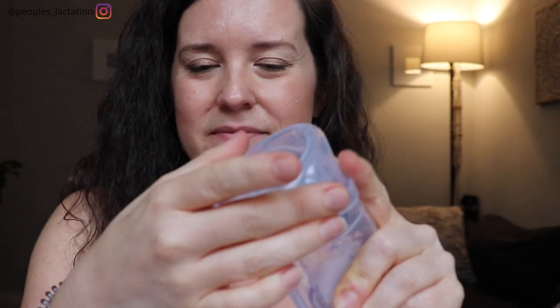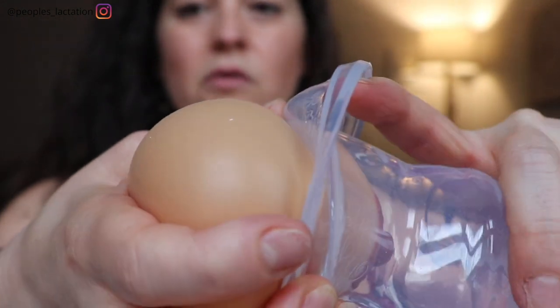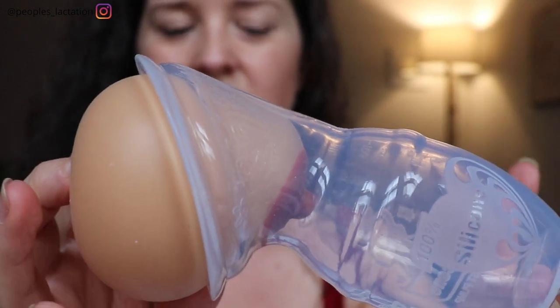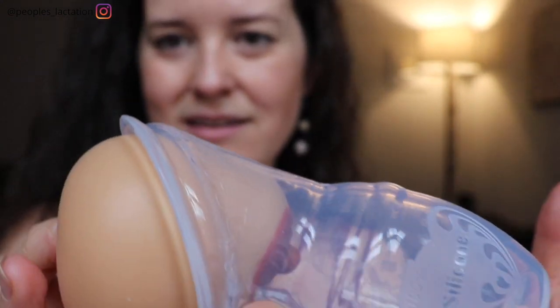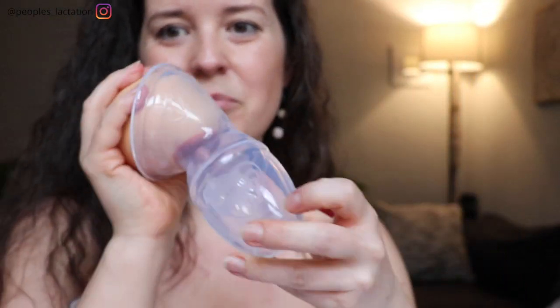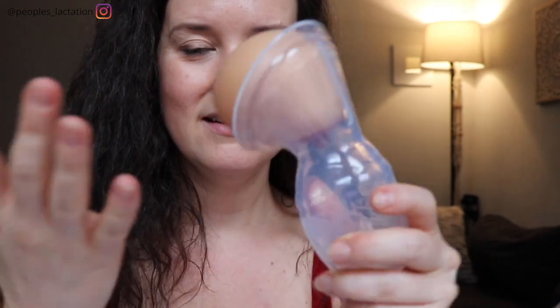The other way to put it on, which is going to form even stronger suction so this thing is not going anywhere, is to squeeze the bottom, then flip the flange part inside out. You might have to hold it down a little bit, then you flip the flange part back up over the breast and let go of the bottle. As you can see, this pulls the nipple even farther into the pump and it's going to stay on — this thing's not going anywhere. Once you get that suctioned on and once you experience a letdown, you're going to see the milk start spraying down into the little bottle, and trust me it's really satisfying to see that and feel that relief.